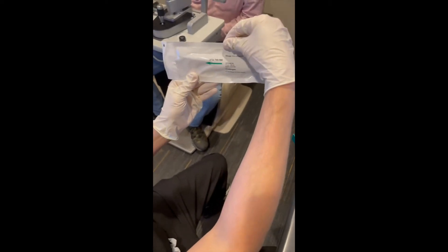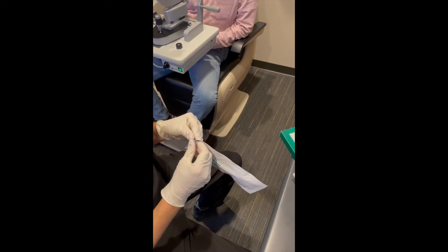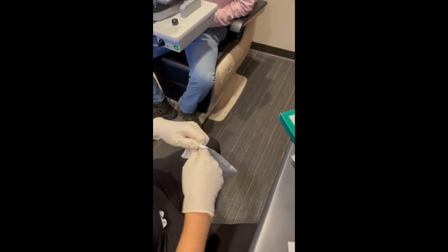Then it says open this way. So you open it with both sides opening up. And as soon as you open this up, everything on the inside of it is sterile.